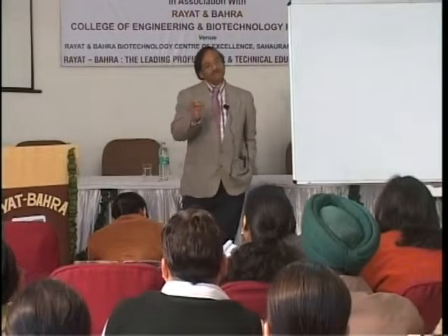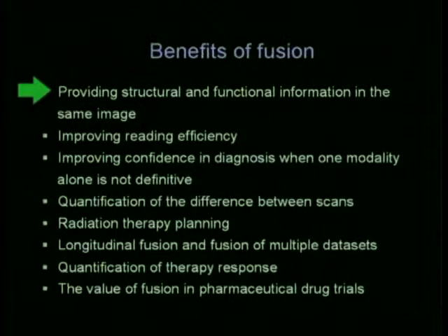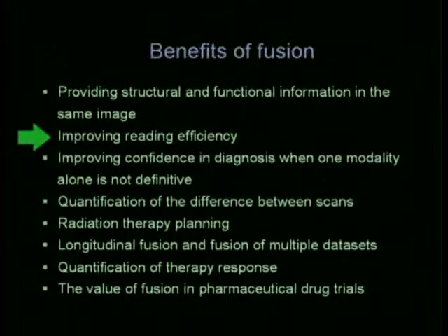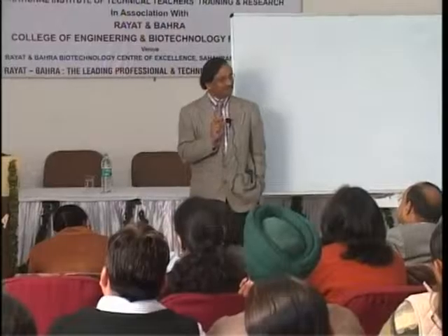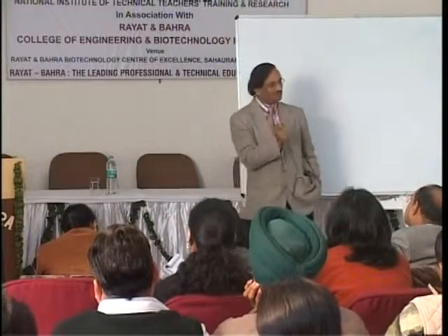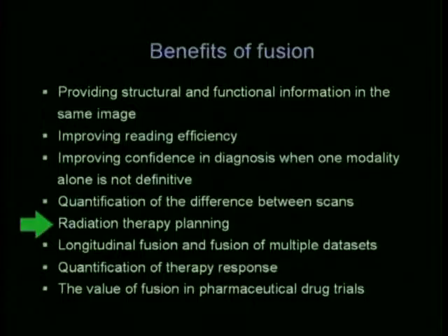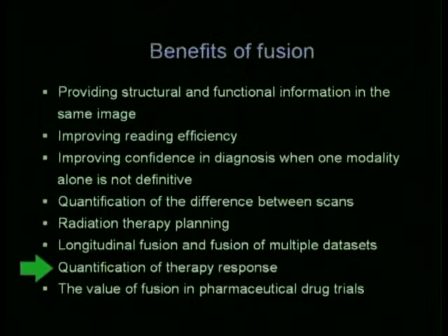Now what are the benefits? So far what we analyzed is that it provides structural and functional information in the same image. It improves the reading efficiency. As a radiologist, the confidence of diagnosis will be improved. Quantification of variations or difference can be done. You can plan radiotherapy. You can also quantify the radiotherapy response.